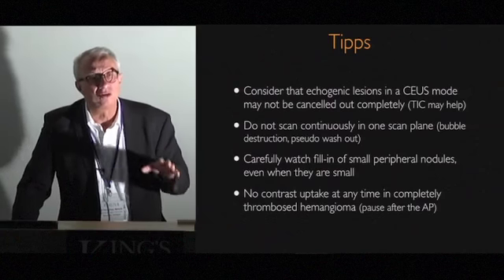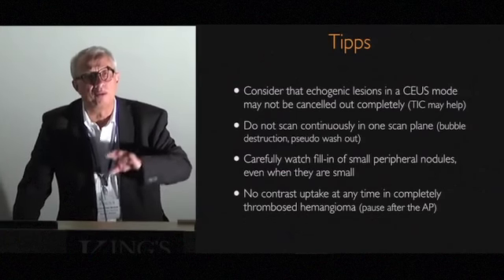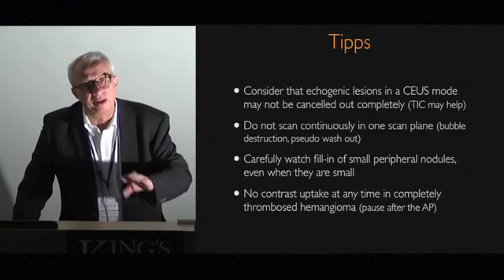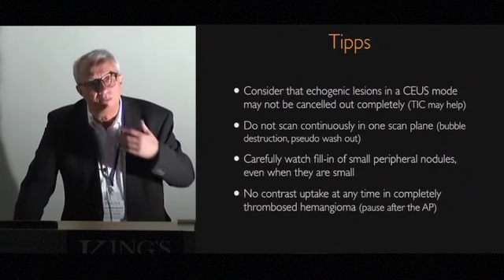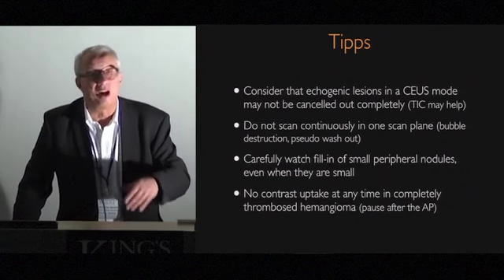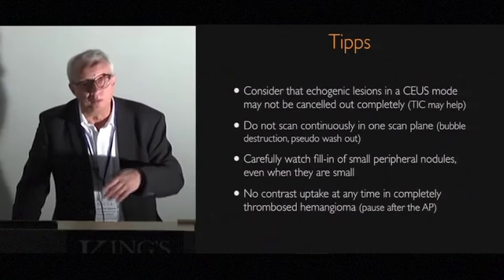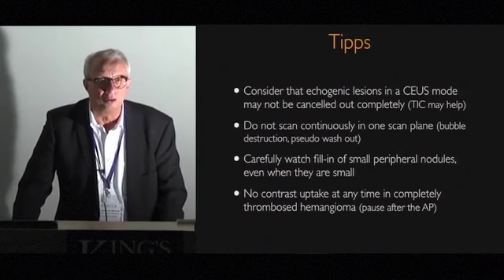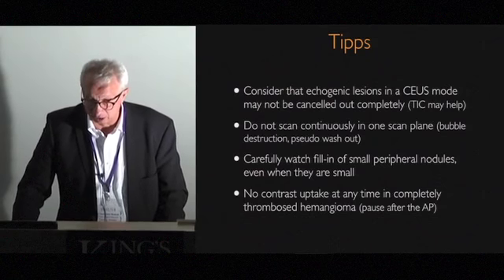So don't do that. As soon as you have realized, yes, we have a peripheral nodular enhancement, stop scanning. Wait a bit, and then scan again, and then you can see a progressive fill-in. Do not scan and say, oh, I need to record it over 5 minutes. Don't do that, so then you have hemangiomas that look different and not like hemangiomas.